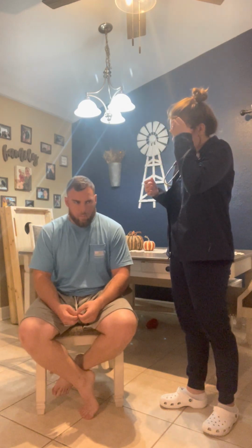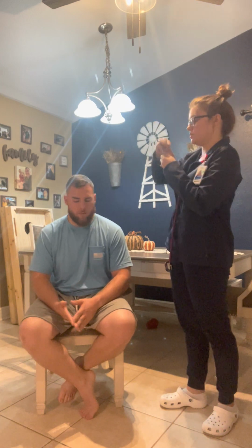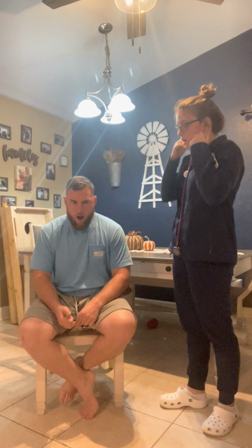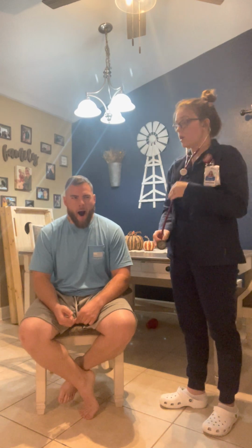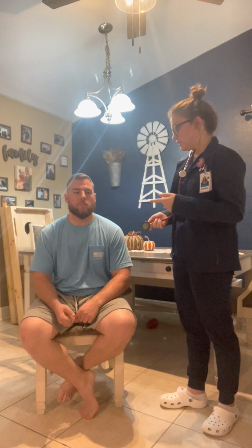So next I'm going to start with your cardiac assessment. We're going to be listening for any murmurs, which you would listen for with the bell of your stethoscope. We're going to listen to your carotids. This is what I'm going to listen for: bruits. And as I'm listening to your normal heart sounds, I'm going to make sure I don't hear any other murmurs, S3 or S4 sounds. So first I'm going to listen with the bell at your carotids.